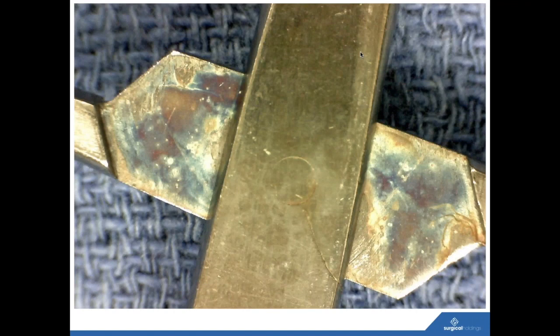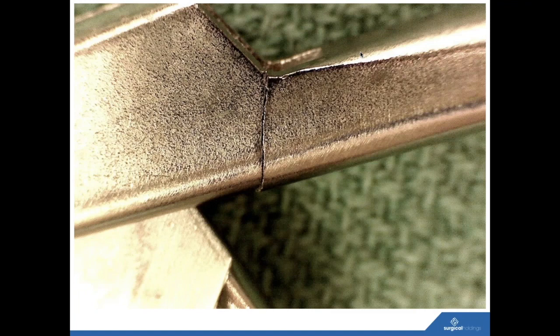Again, just to share another image of silicates, you've got a stress corrosion crack there in the device. It could be where it's not been lubricated and it's put stress on the rivet and on the box joint while it's being used. And there are the lovely colourful silicate colorings from the coatings. Obviously, another crack where the device has been overstrained, not related to water, but relevant all the same when you're inspecting and looking at instruments, to try and really use some good magnification to pick up these issues along the way.